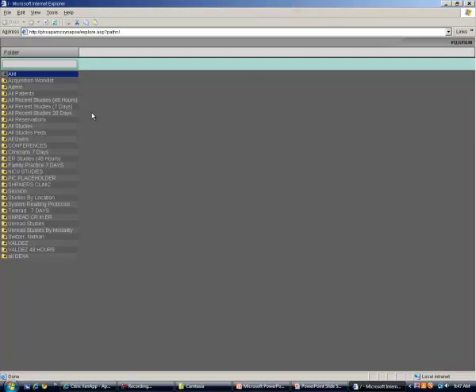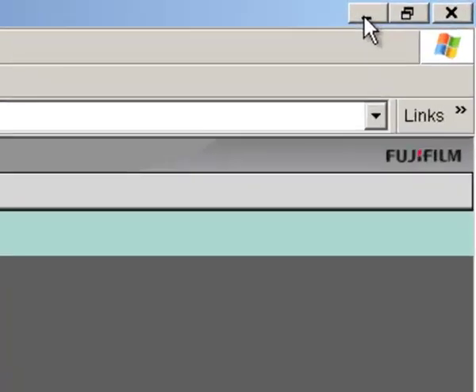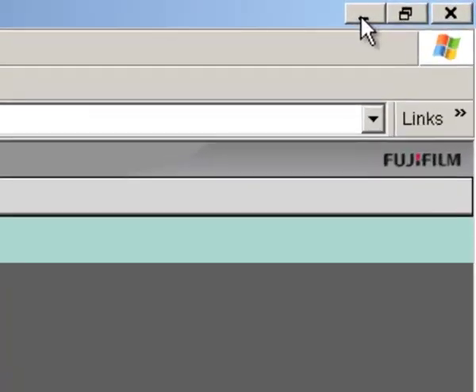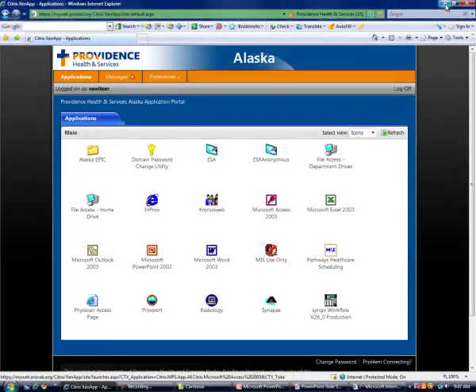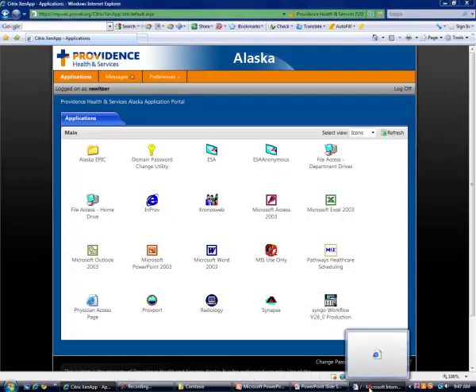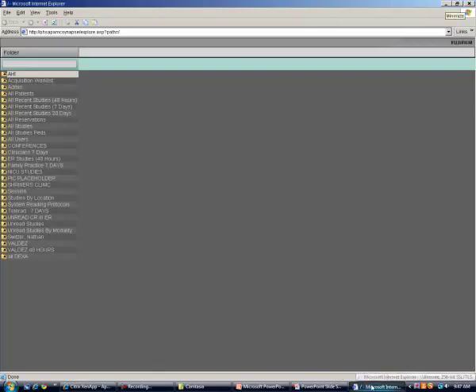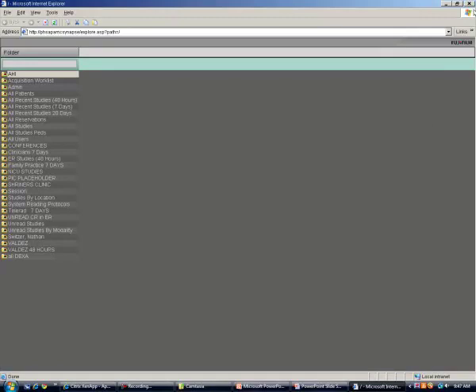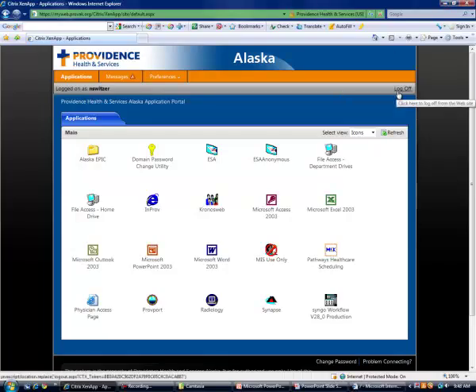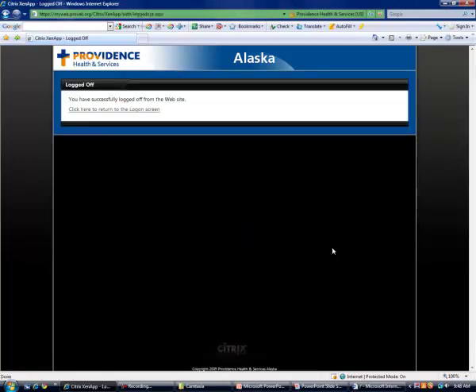To keep Synapse open all day long on your computer, do not close this window. You may want to minimize it by clicking the underscore symbol of its window like this. As long as you do not close the program by clicking the X at the top right of the screen, it will stay active and refresh itself periodically with the latest patient information. Your application screen will eventually time out and log you off, but you can still use Synapse as long as you don't close the Synapse program.